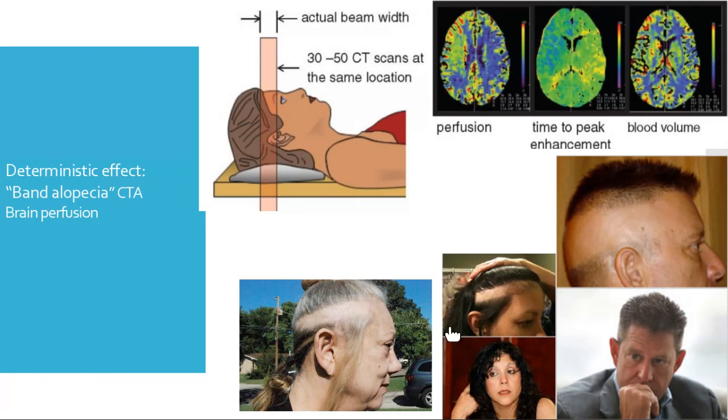I will focus specifically on radiation in CT perfusion. As you know, in CT perfusion we use a fixed table, not rotating as in other investigations, because we would like to image or scan a specific volume. In CT perfusion, we have a specific area, and we will measure the radiation or the blood flow in that area.